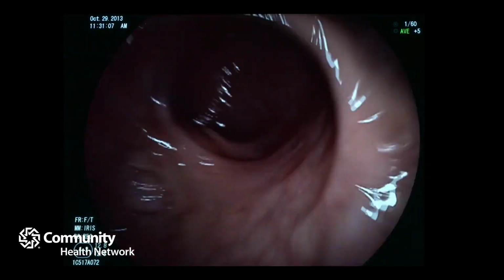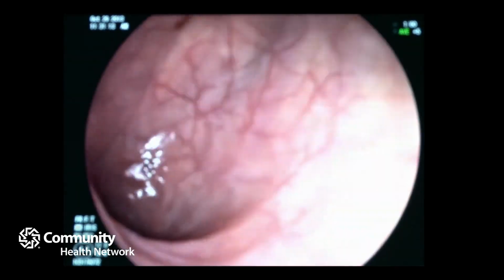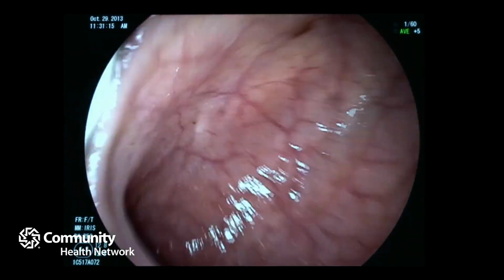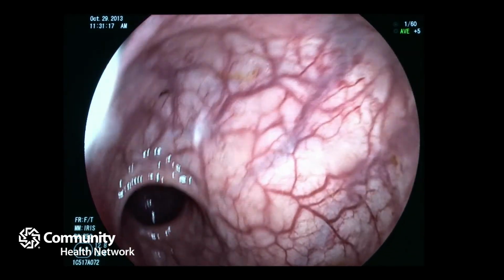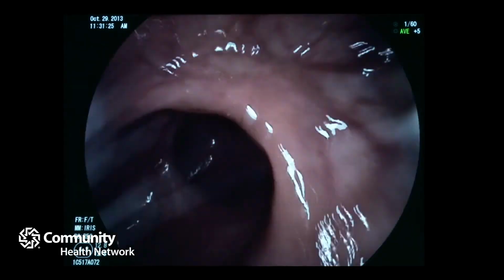So we're back in the rectum again. These are those valves, 1, 2, 3. Anything here and below is basically rectum, and above that is colon. So I think most of the time it's just eating smart. Anything you do for your normal life, I think, will be good for digestive health. I just am a little bit bigger believer in probiotics than maybe others are.